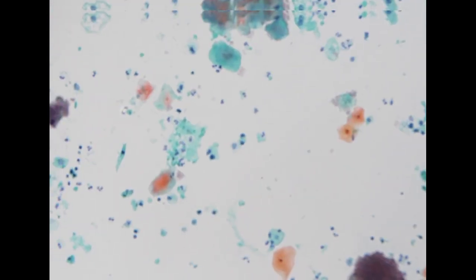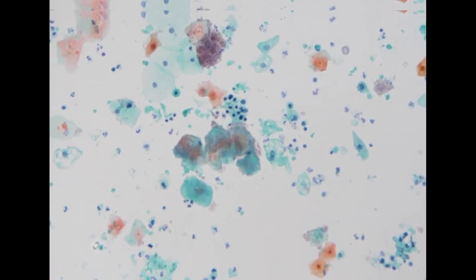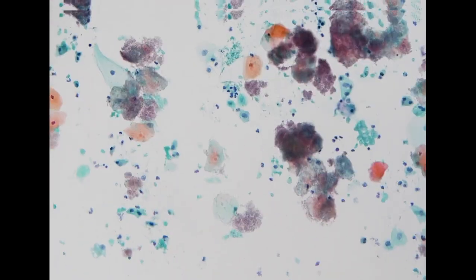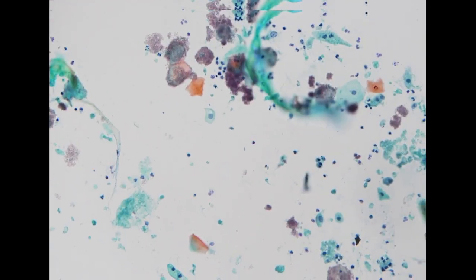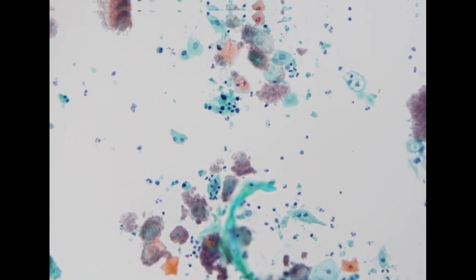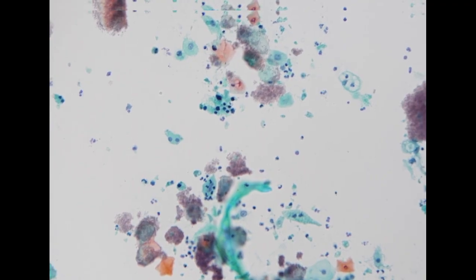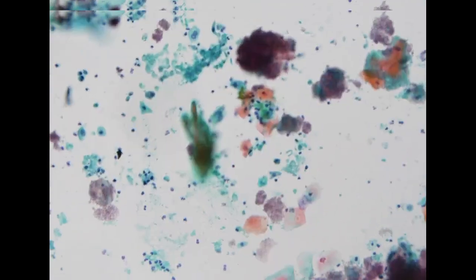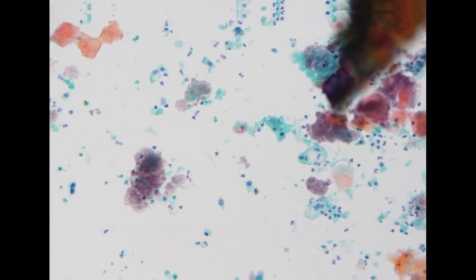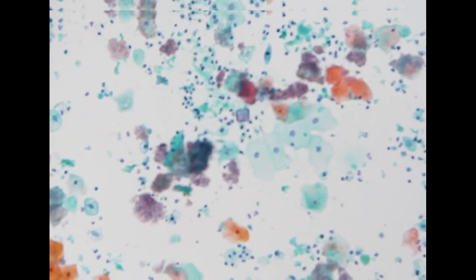So overall, this is the very first specimen for this patient in our hospital after the clinical presentation of hematuria. Hematuria can be due to urinary tract carcinoma, but it can also be due to a stone or another problem causing some obstruction. If there is a stone, sometimes it will cause significant nuclear atypia, including hyperchromasia and irregular, angulated nuclear contour.